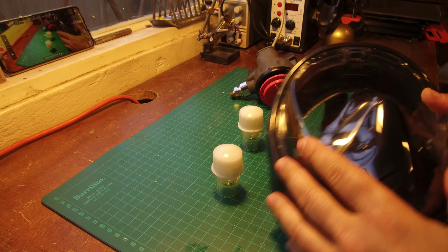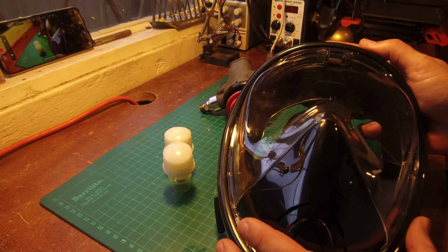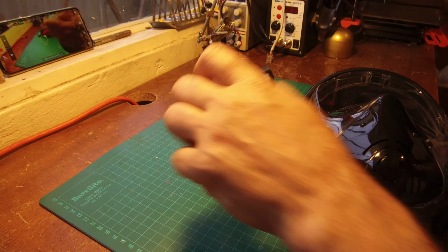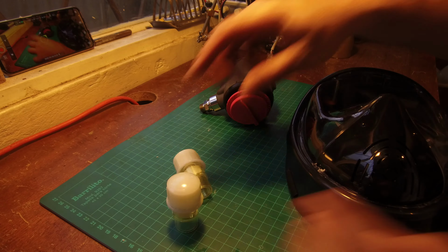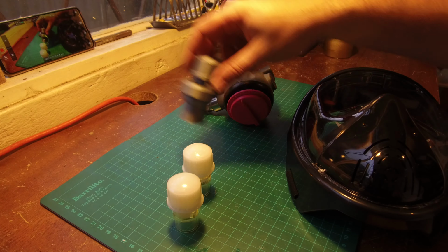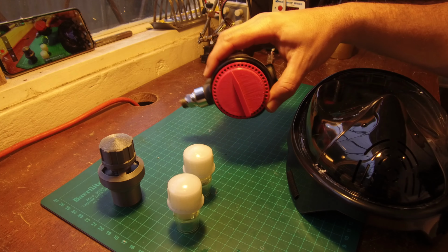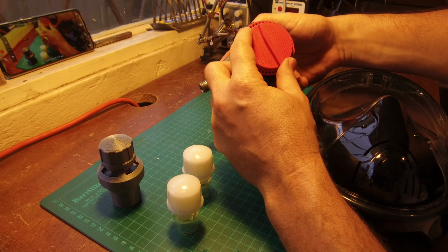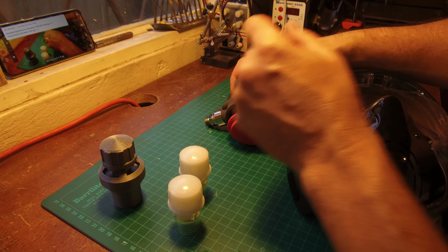So what we need first is these three things: a full face snorkeling mask, some PEEP valves. Don't worry about it, you can find these at a hospital. If you don't have them, I'll provide some other solutions like this 3D printed one. I give you the files, message me and I will give them to you. And this second stage scuba diving regulator valve.